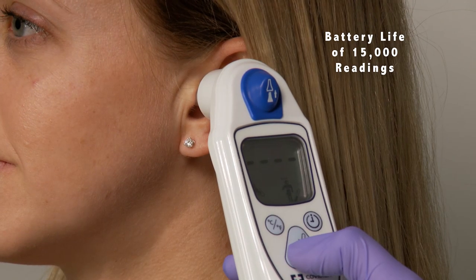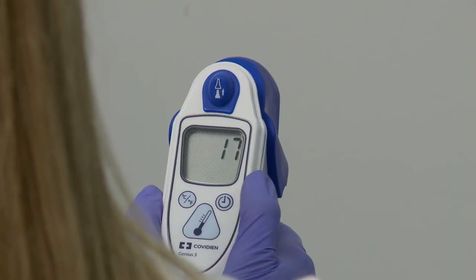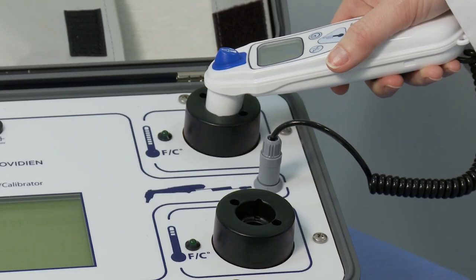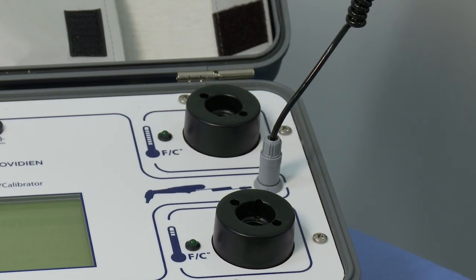It can be used on patients beginning at one month of age, with a battery life of up to 15,000 readings and an easy-to-read programmable LCD screen. Increase efficiency and decrease unit downtime by using our calibrator to check and recalibrate on site.